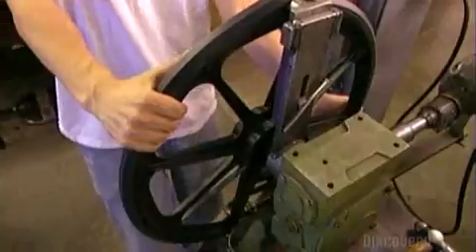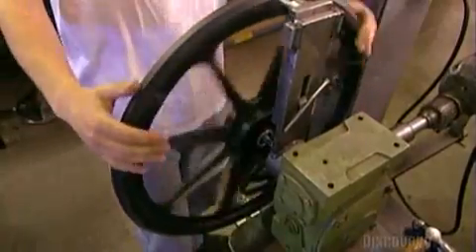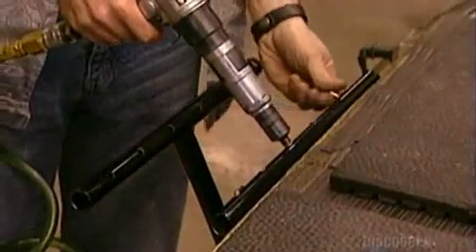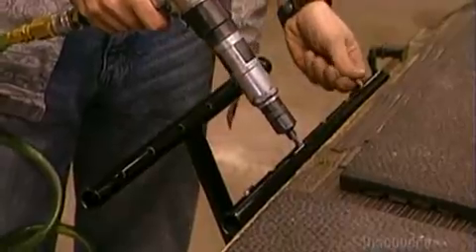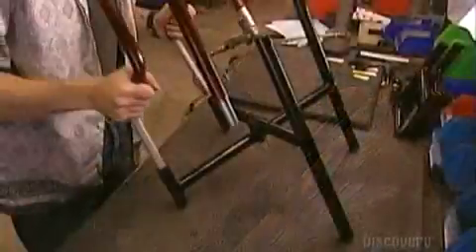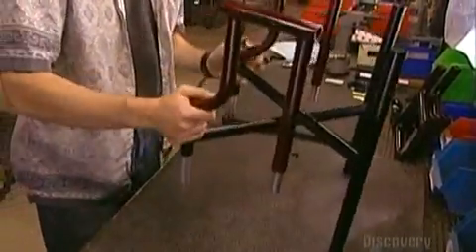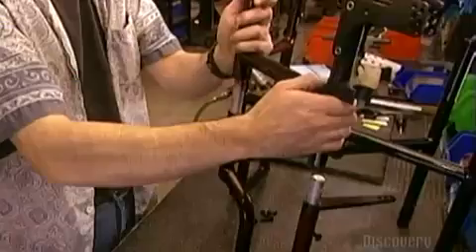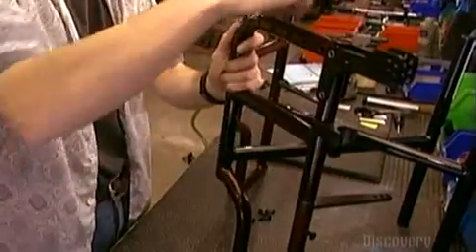The tires are rigid and have no treads because they're designed for smooth indoor surfaces. An aluminum cross frame is what enables the chair to fold. They assemble it with 6 or 7 screws per side, depending on the depth needed for the seat, which they'll install later on. The front part of the wheelchair is called the front frame. Workers lubricate the parts so they'll be easier to install. This also enables the wheelchair to fold with ease.